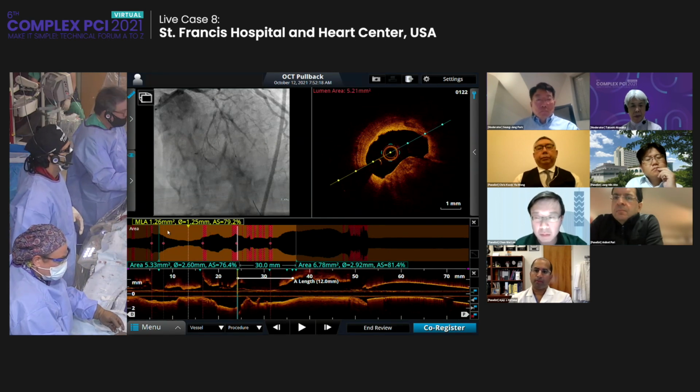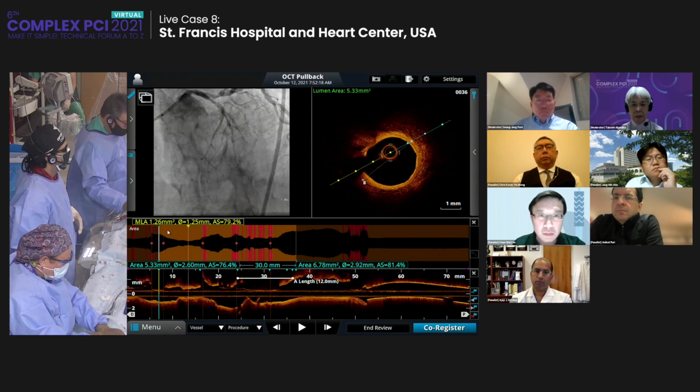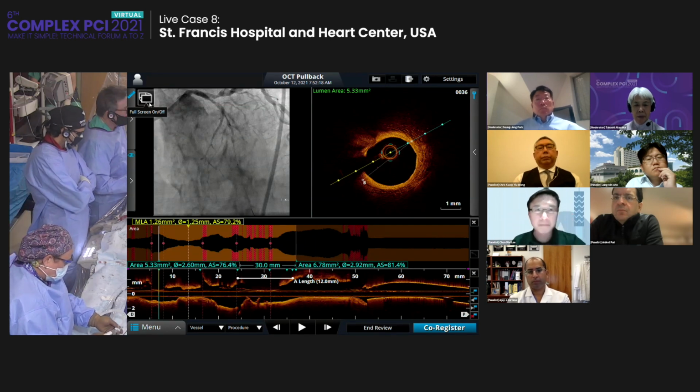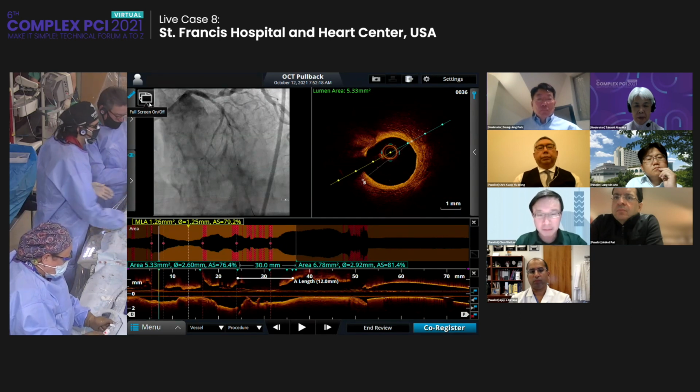The other thing, by picking the 30 versus the 33, is that I try, if I can, to have my areas very close to each other. Here you see distally it's 533 and proximally 678. When we went more proximal, the areas were much higher there. I think they were in the 9s.